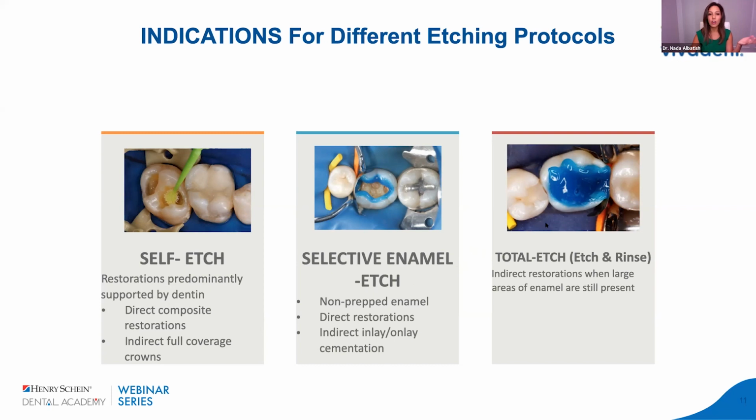Now, total etch, honestly, we learn in school to use this for everything. So as long as you're not over etching, this really is quite possible to just stick to your same system that you've always been doing without changing it up, as long as you don't have any issues. Okay, so I'm going to walk you through now.